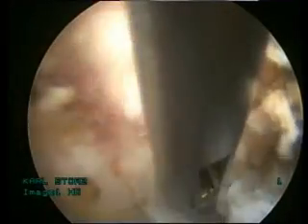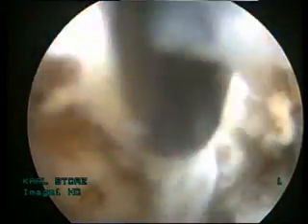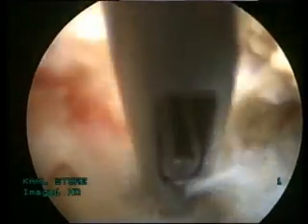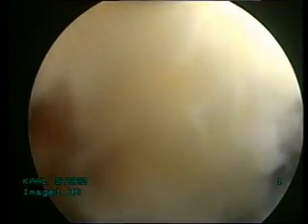On the left side is the exiting root and on the right side is the dural sac, and we are removing the fragment slowly. The fragment is likely adherent to the surrounding nervous tissue, so gentle maneuvering is performed to ensure removal is safe and not excessively painful for the patient. The patient does experience pain because we are recreating the situation causing the symptoms, which also confirms this is the fragment responsible for the patient's complaints.